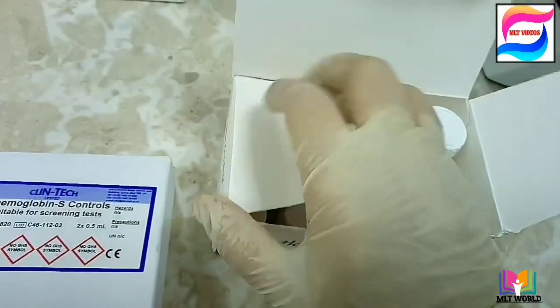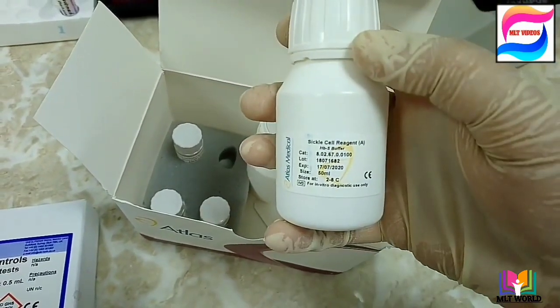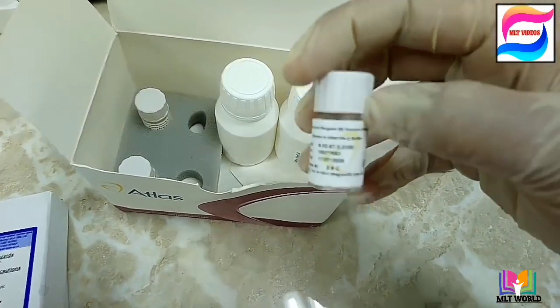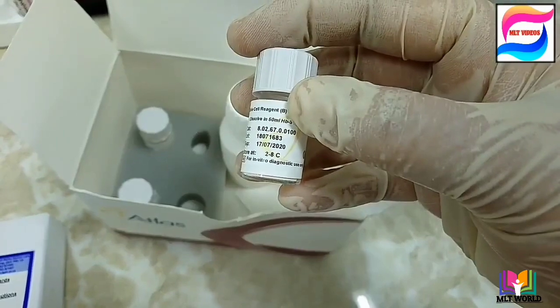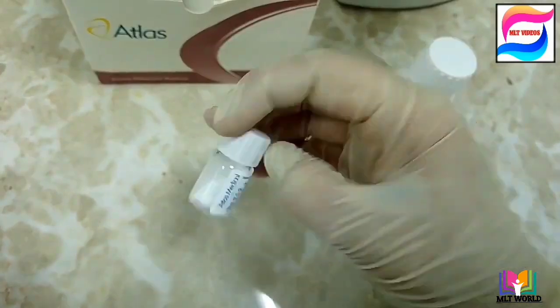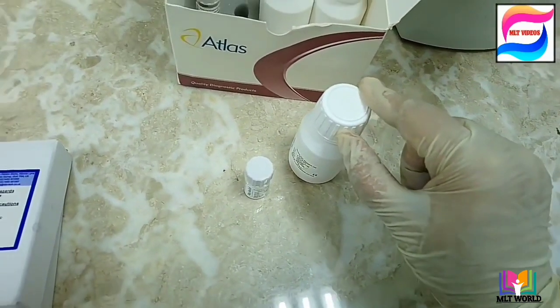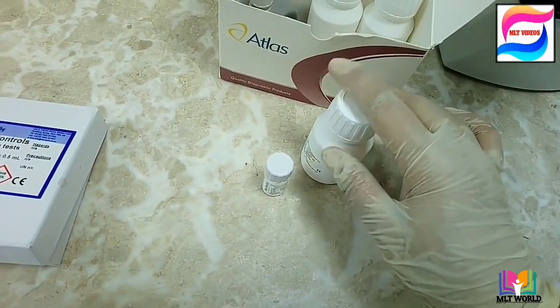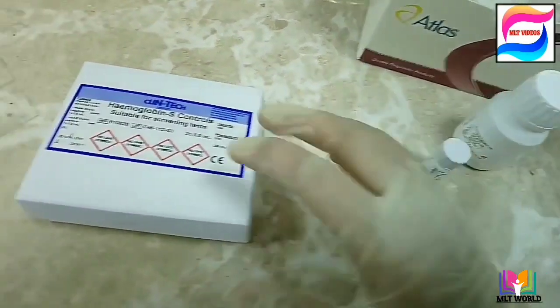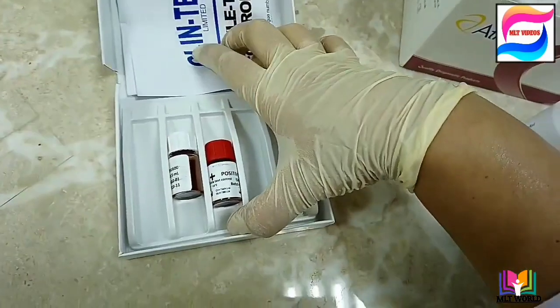For this test we are using the Atlas kit, which contains two reagents: Reagent A and Reagent B. Reagent B is in smaller quantity. Note: always check the expiry of the kit before using it. These are the sickle cell controls we will use to verify the reagent is in working condition.